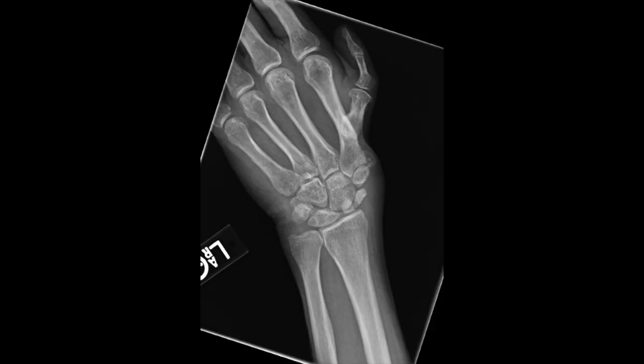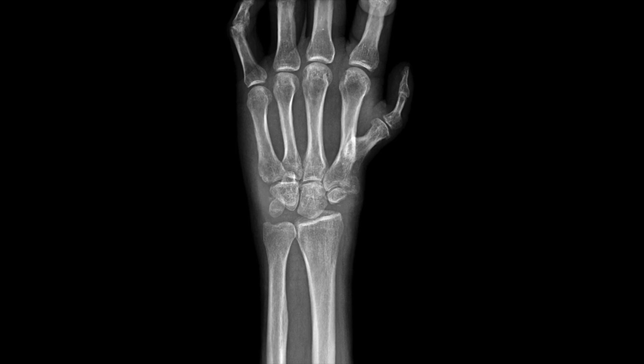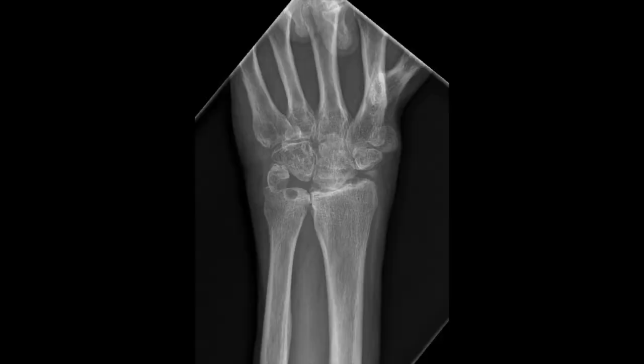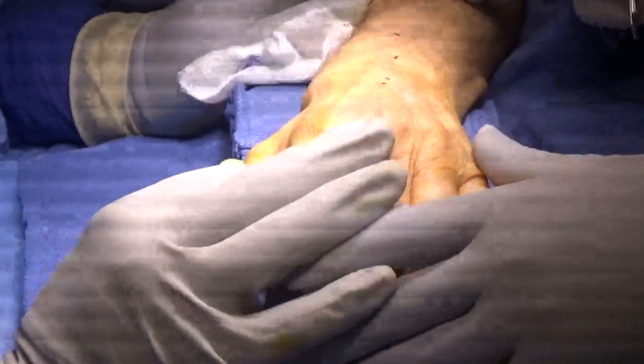The patient is a 62-year-old male with a history of Klippel-Feil syndrome with congenital abnormality to the wrist. He underwent a proximal row carpectomy approximately 10 years ago. These are his post-op radiographs. He presents now, approximately 10 years later, with advanced degenerative changes to the capitate and to the lunate facet. Patient is scheduled for total wrist arthroplasty.